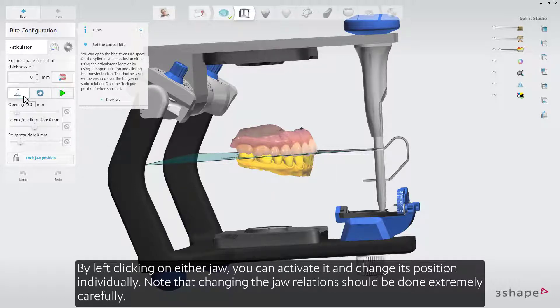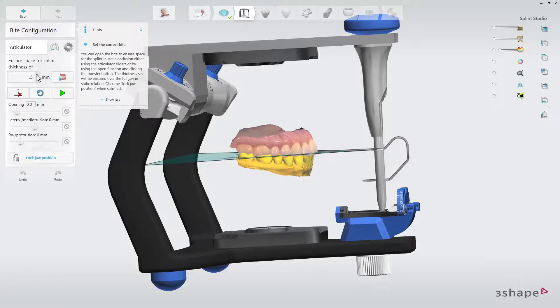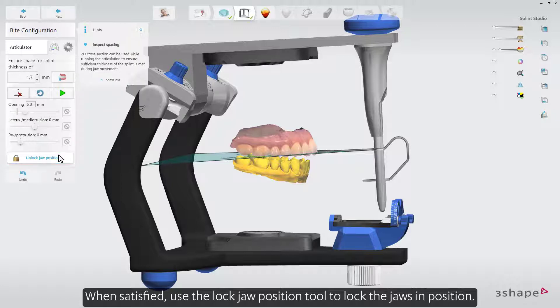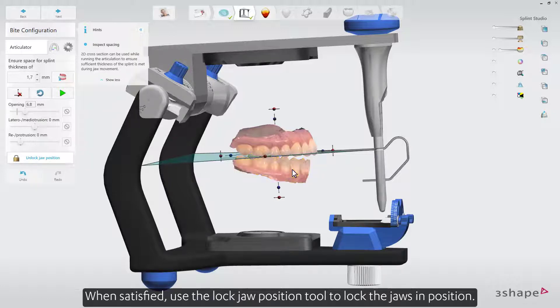Note that changing the jaw relations should be done extremely carefully. When satisfied, use the lock jaw position tool to lock the jaws in position.